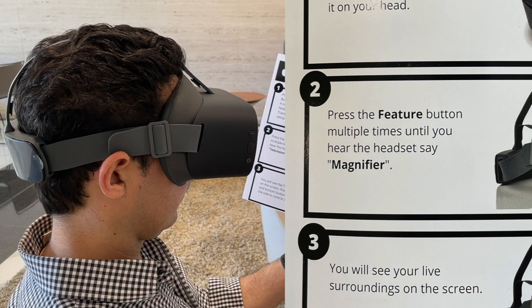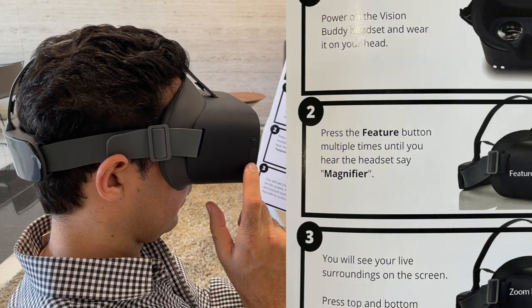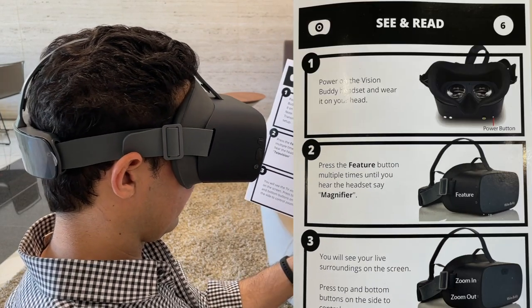You can magnify anywhere up to 10 times with this feature to help you read prescriptions, writing, and other small details.